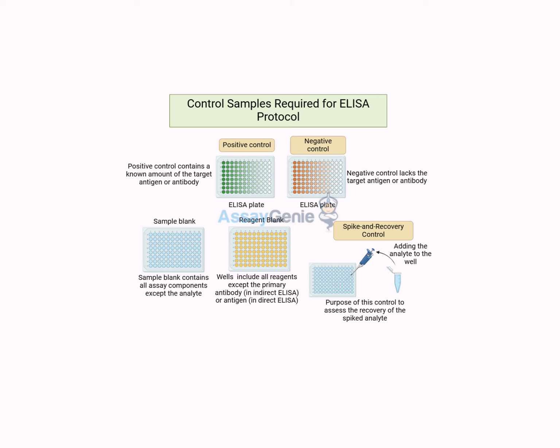So it's not just about detecting the antibody in the patient's sample, it's about confirming that the test itself is actually capable of detecting it. What if that positive control fails? That's a big problem. That could mean that the reagents have gone bad, or maybe the equipment's malfunctioning, or there's an error in the procedure. It basically invalidates that entire batch of tests.